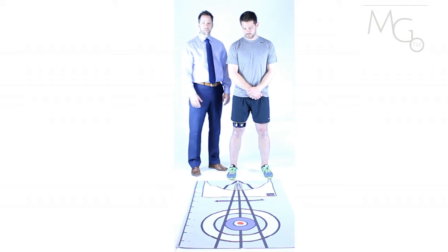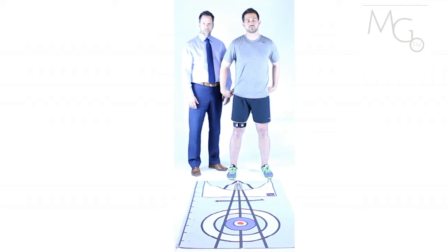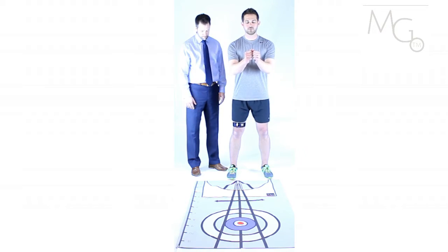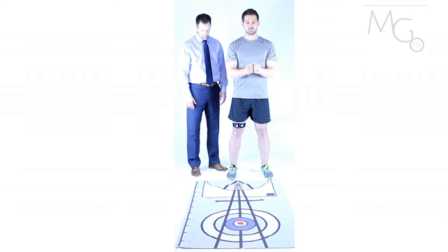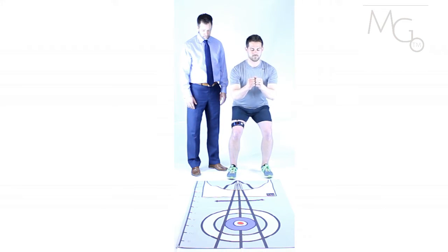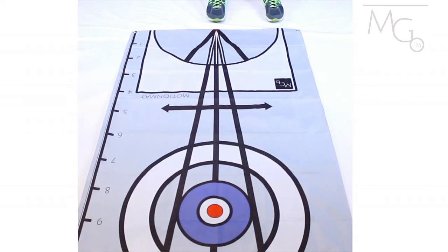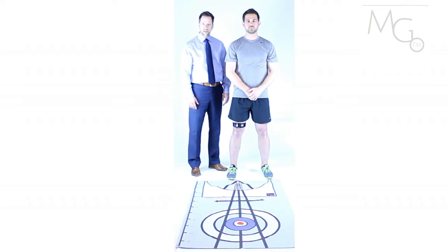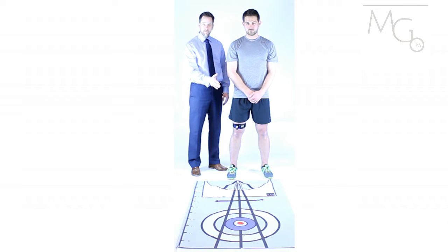For this example, we'll have the patient perform a standard squat. This will allow us to both assess what motions are happening at the knee and the lower chain, as well as give the patient immediate visual feedback on what motion is happening. Ideally, we are looking for deviations outside of the normal, which might include excessive knee valgus — therefore the laser would go across the midline of the flag — or inappropriate proprioceptive deficit, which might include shaking of the laser throughout the range of motion.